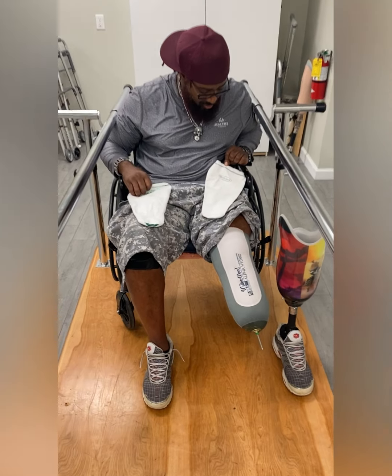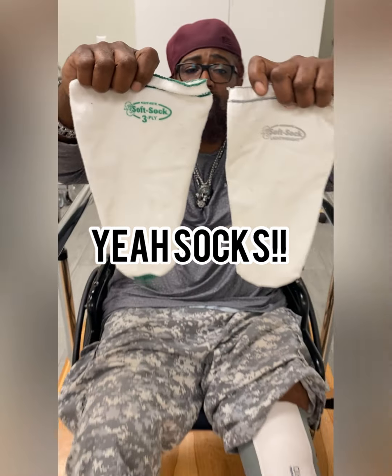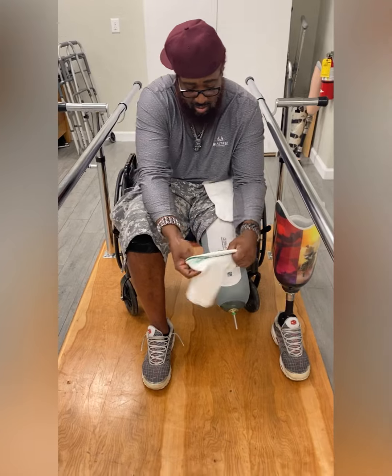Now let's review some sock maintenance. If the prosthesis feels loose or is rotating, feel free to use a sock. They come in ones, threes, fives, and other various sizes. Pick a sock that you feel would be appropriate and don onto your limb.